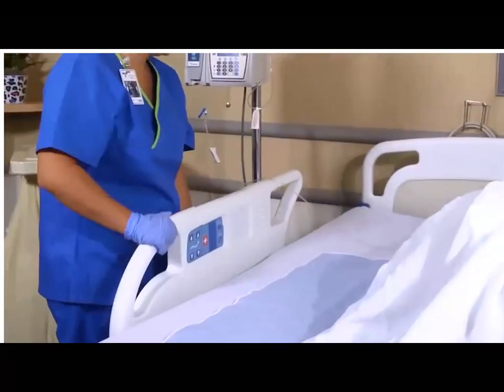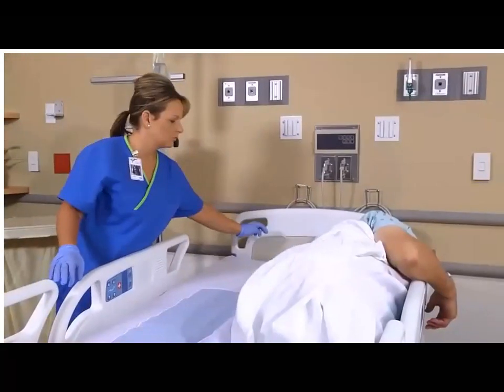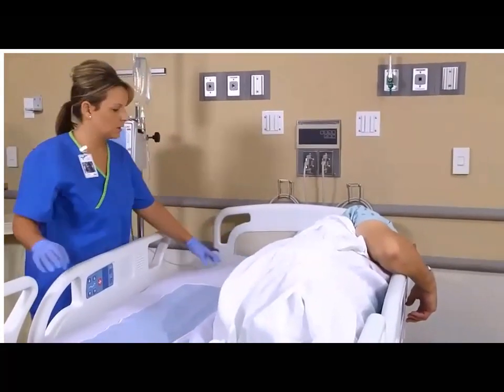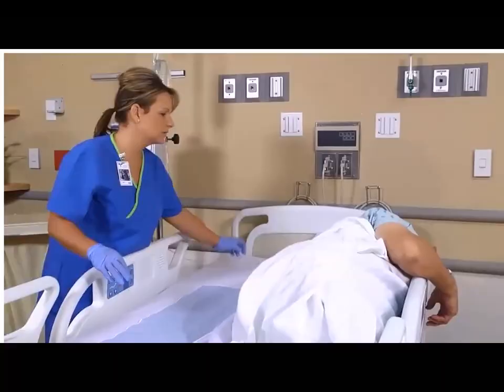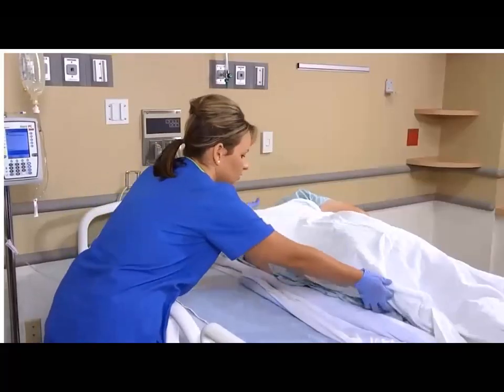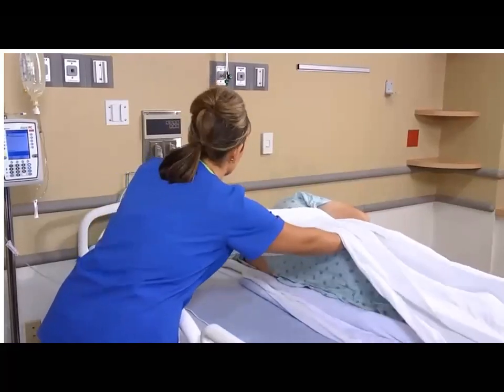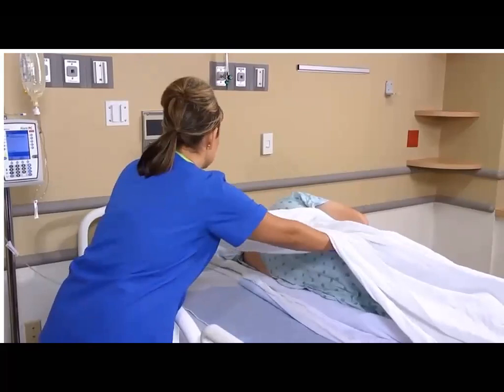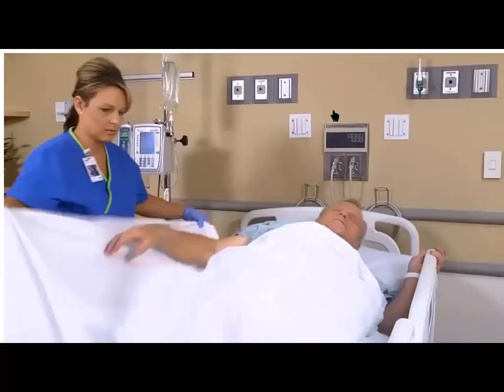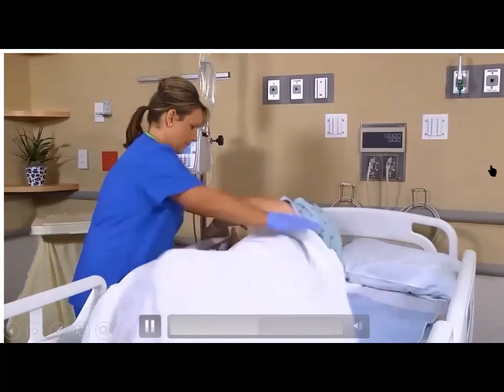Now raise the side rails and ask the patient to turn toward you. Explain that he will be rolling over layers of linen. Okay, Mr. Hayes, I'm going to have you roll towards me. Okay, and you're going to feel a big hump. Help him roll toward you, making sure he turns slowly and keeps his body correctly aligned. So go ahead and roll towards me. Okay? Yeah. You doing okay?